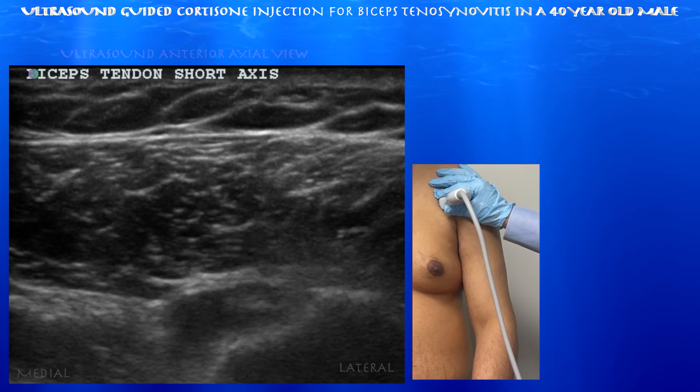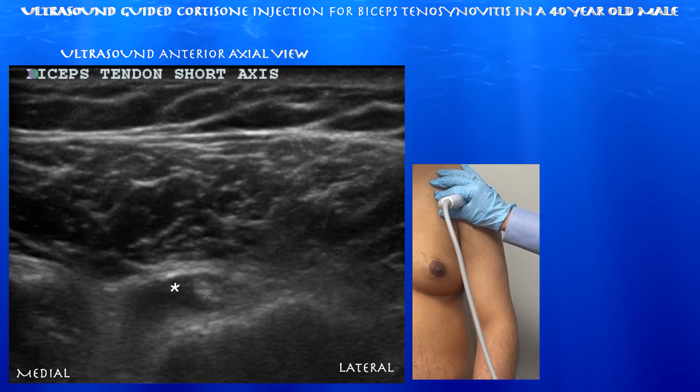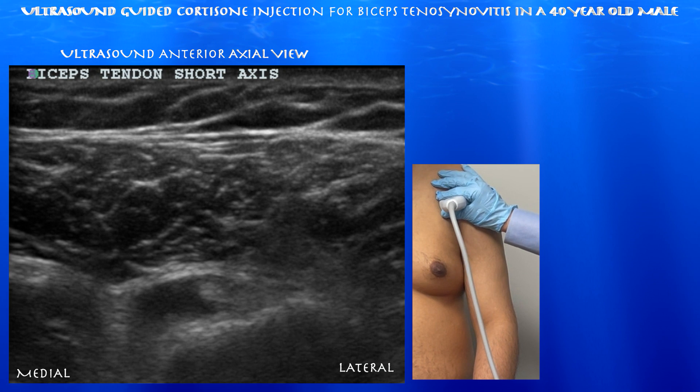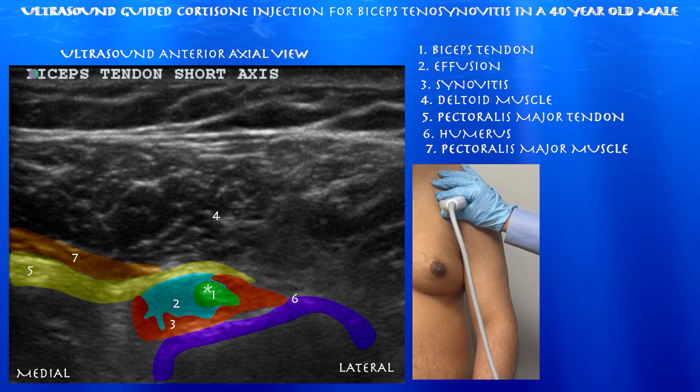Here we're looking at the biceps tendon in short axis. You can see a fairly sizable effusion around the biceps tendon. This is really proximal, just beyond the actual shoulder joint itself. Again, you can see the effusion around the biceps tendon and some synovitis around that as well.